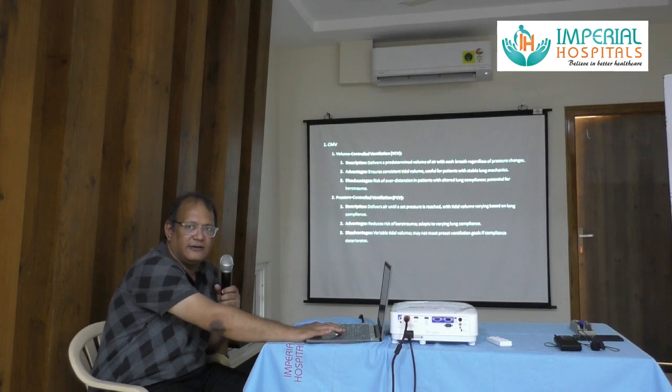Pressure control ventilation is where during inspiration a set pressure is reached, and tidal volume varies depending on the lung mechanics. How compliant the lung is. If the lung is more compliant, more volume will be delivered. If it is less compliant, tidal volume will be less.